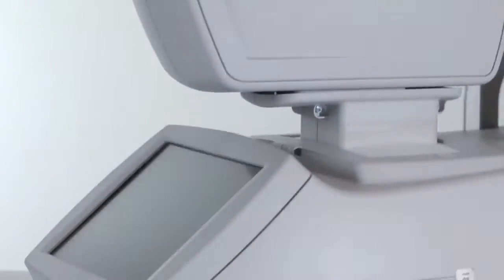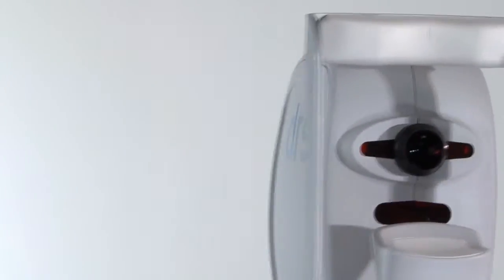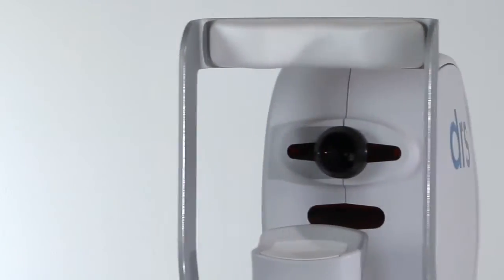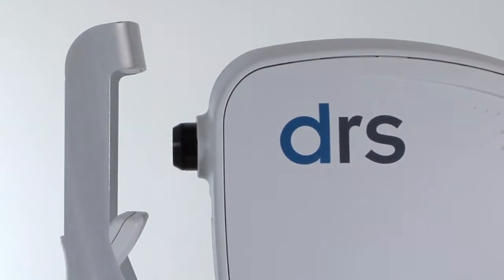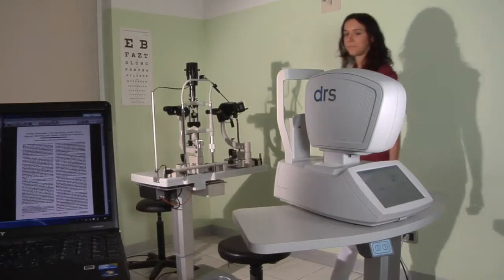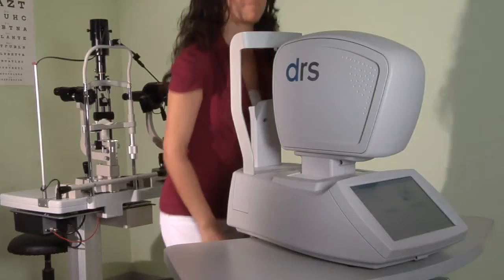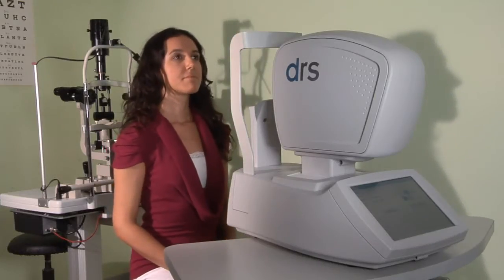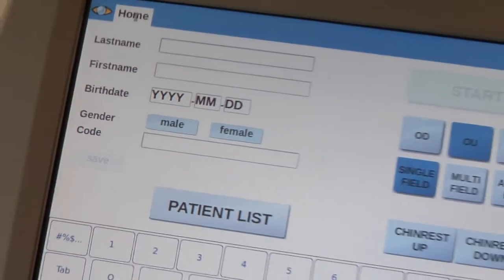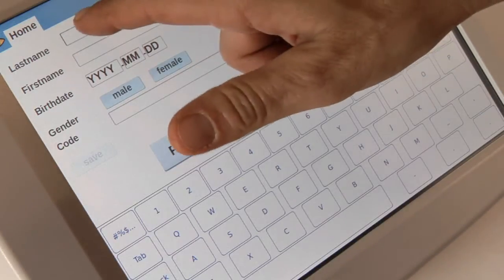The DRS is a non-midriatic retinal camera that is fully automated. Conceived to maximize patient flow, the DRS allows for large-scale screening programs which are key in the prevention of diabetes-induced vision impairments that can lead to blindness.